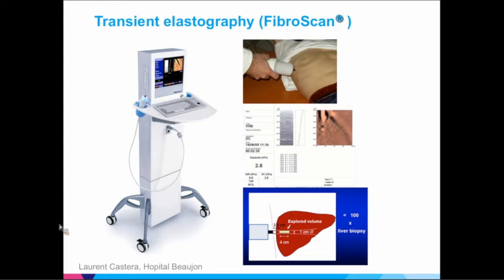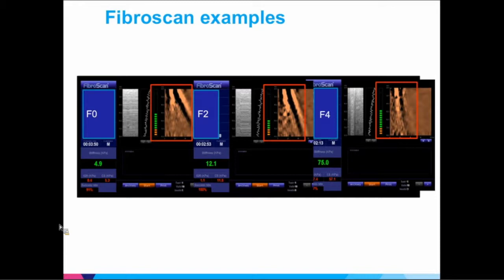Here are some FibroScan examples — two different cases, F2 and F4. The interest of FibroScan is that there's so much data that we're able to stratify by etiology of liver disease. You'll have a scale depending on etiology telling you the risk of having F2, F3, or F4. We're using 12 kilopascals as the marker here for F3 accuracy. In this case, the patient had F2 and measured 12 kilopascals — accuracy is variable depending on etiology and patients.